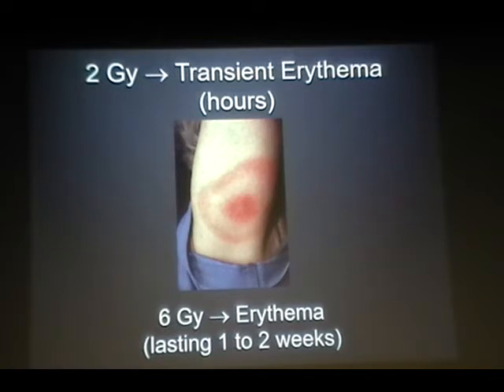that we could use. Okay. 2 grays, it could cause transient erythema. There was an assistant technician, basically first time on her job. She was put on the CT scanner. She was pressing the button, and the radiation was releasing. She didn't realize that, and she got sued. That's a different story. So please make sure you don't keep on pressing the button. When you press the button, radiation will be released.